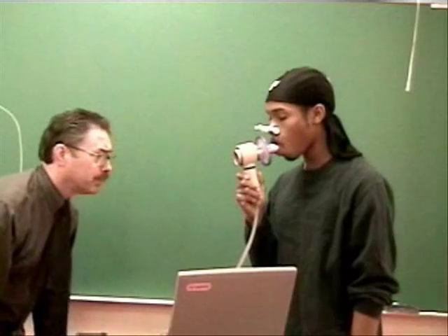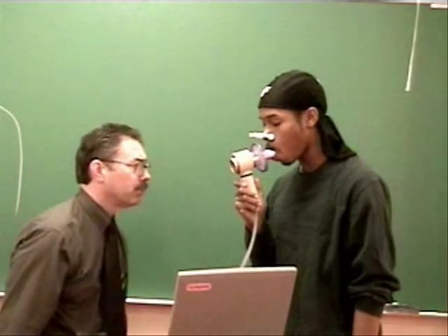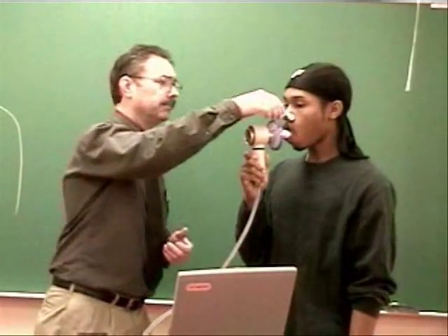Blow, blow, blow, blow, blow, blow — real hard. Push, push, push, push, push, push. Keep pushing, pushing, pushing. Big breath in. Sucking deep, real deep. And...let it out. Good. Good.